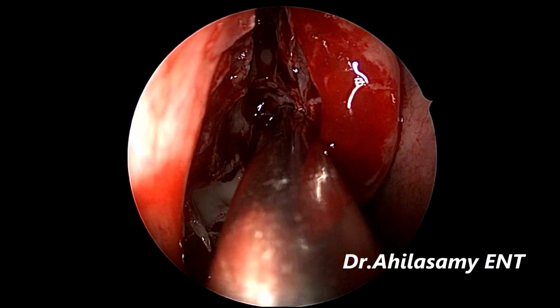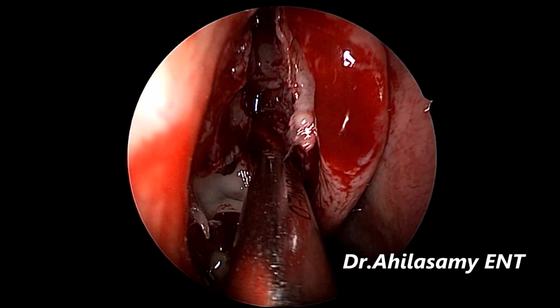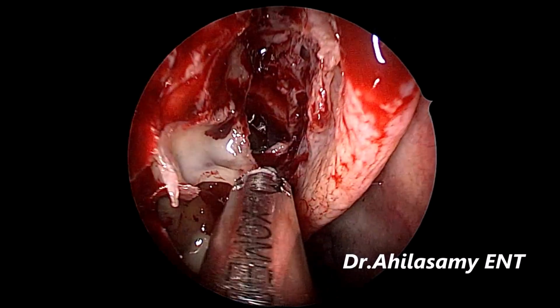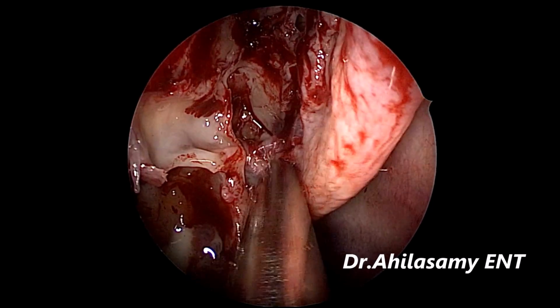It is almost a full house FESS except sphenoid, very well done on both sides under local anesthesia, very comfortably on a 76-year-old male patient.